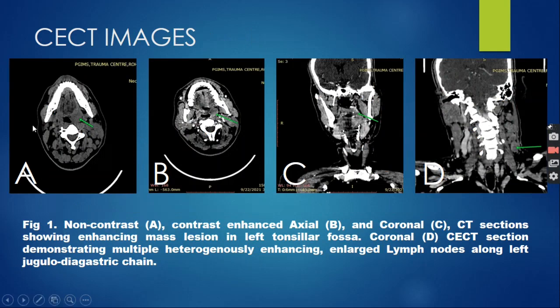These are the CT images. In this axial section and coronal section, we can see a heterogeneously enhancing mass lesion in the left tonsillar fossa. In this coronal section, we can see multiple lymph nodes along the left jugulodigastric chain.